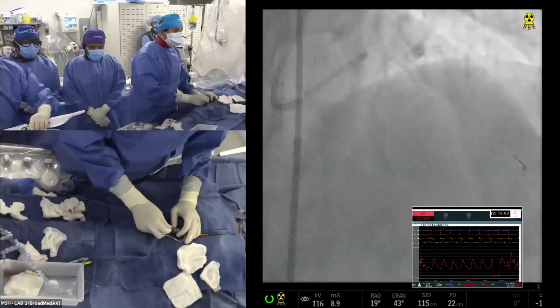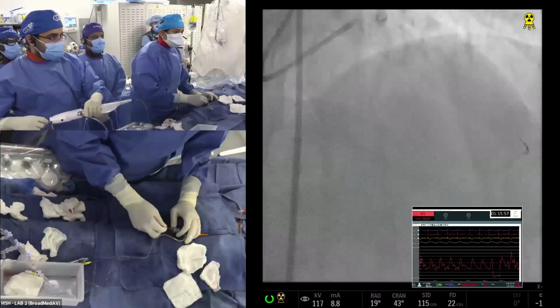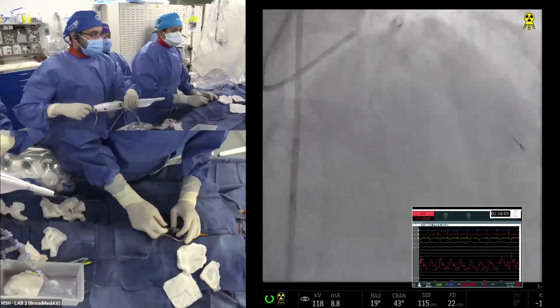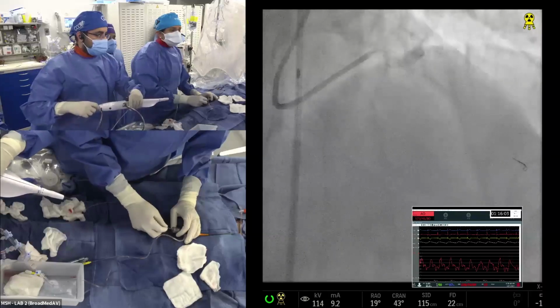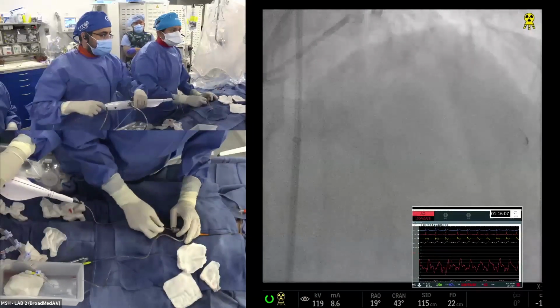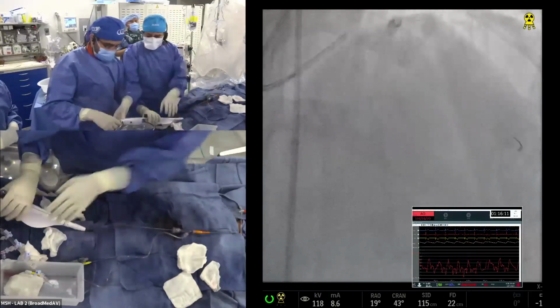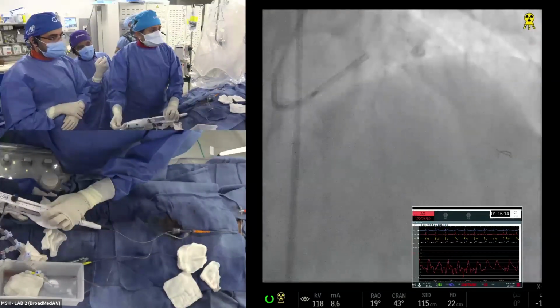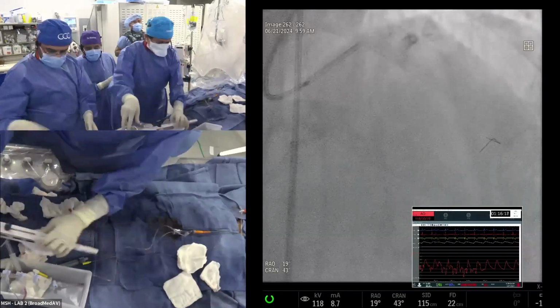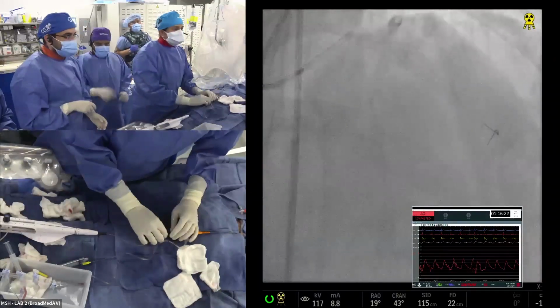Same push and pull. Just for the audience, this is a 1.5 burr again. Earlier it was 175. Pull the wire back a little bit, it's too distal. I also say that if the wire tip is in some side branch, make sure you pull back, because that will cause a perforation as the wire still moves. Once it curls up like this, that's okay. But if the wire tip goes to a small branch, we just had one a few weeks ago here at Mount Sinai, where the wire remained in the side branch.